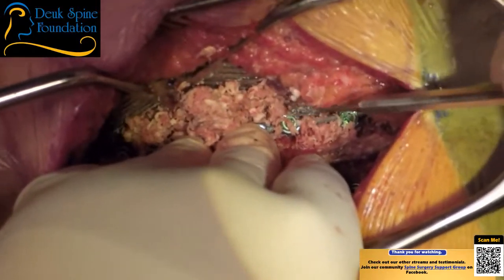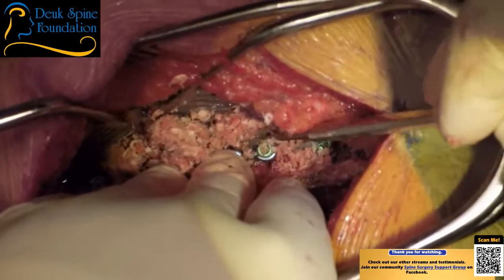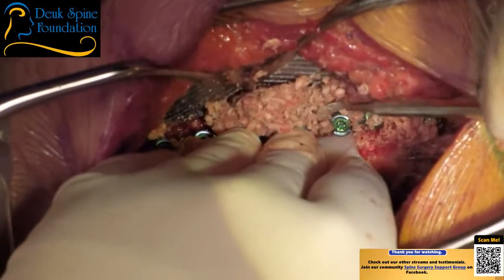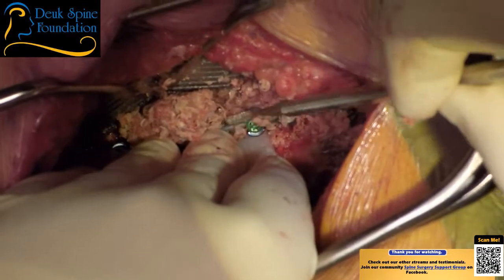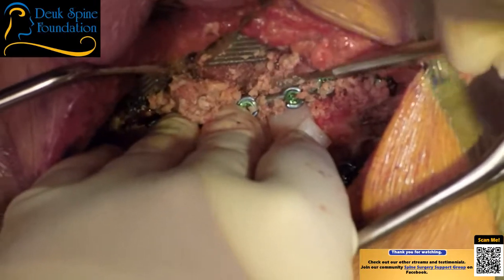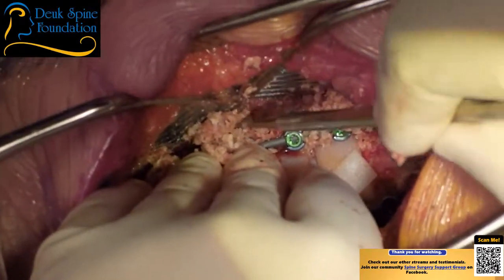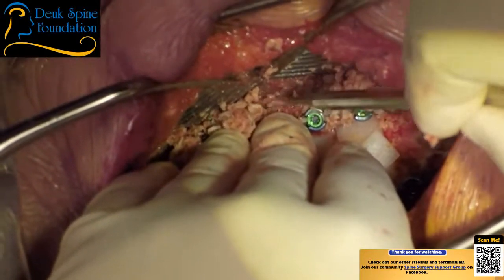The second thing spine surgeons do is we realign the spine, put it back into the alignment that it's supposed to be. And it's very important. And Dr. Atwater is a surgeon who also very seriously takes that into consideration. But many of the surgeons don't. Right, Dr. Atwater? I can't speak for the other surgeons, but yeah, it's been an issue. I know surgeons doing lumbar fusions on a Wilson frame or on a flat table. Of course, the patient's going to be kyphotic to straight, flat back when they're done because they didn't use the right table to do the surgery. You need a Jackson table.